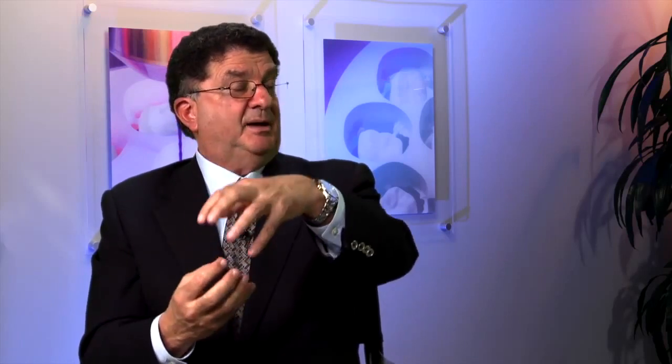I think the biggest problem is still subgingival placement of margins and so on. But with implants having standardized size for the most part, you know what the size and shape, you could put impression copings on and not worry about blood. So for implants, as opposed to teeth, it's like a no-brainer. Just scan. No margin. Even if it's down there and deep, it doesn't matter. You can put an impression coping on. As long as that coping has an index on it, you then know where the hex is, or the octagon, whatever you have, or tripod. You know exactly where it is based on the abutment impression coping, and you pick that top, take a picture of the top, and the technician can read that and then know exactly where to work from there. So I think it's here to stay. It's just a matter of price and speed at the chair side.